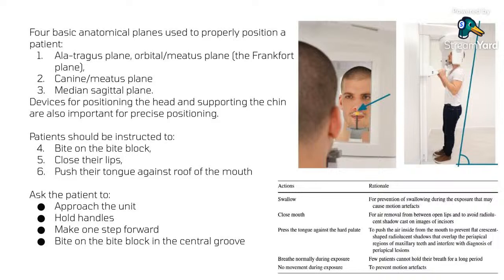The panoramic x-ray machine rotates around the patient, and if the patient is tall or has broader shoulders, they may come in the way while it is rotating. So you will ask the patient to tuck their shoulders inside while the exposure is being made, cross over their arms on the handles, something like that.